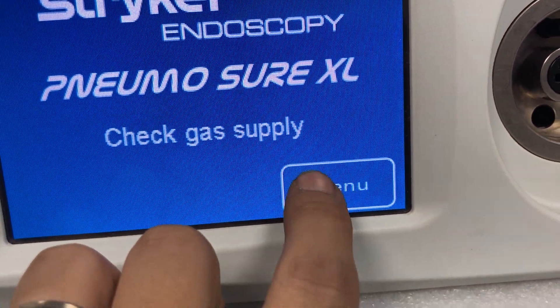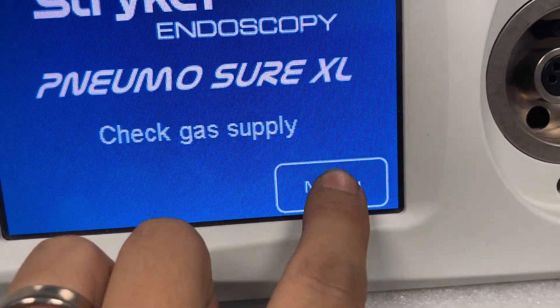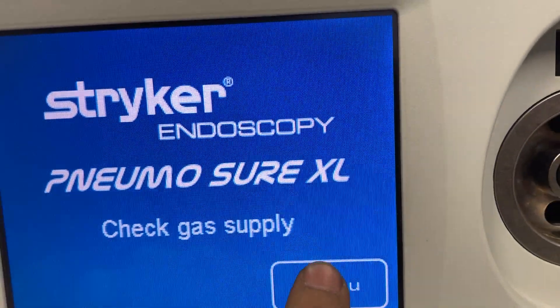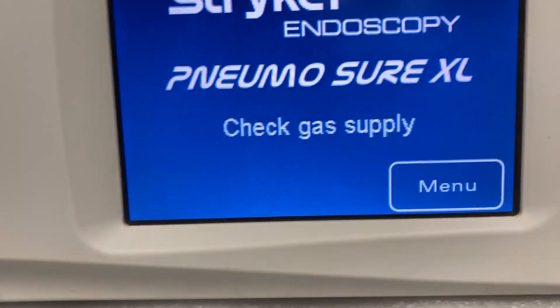If you try a number of times it will eventually bring up the menu screen, and after that point it's actually quite easy to use — it's quite responsive.